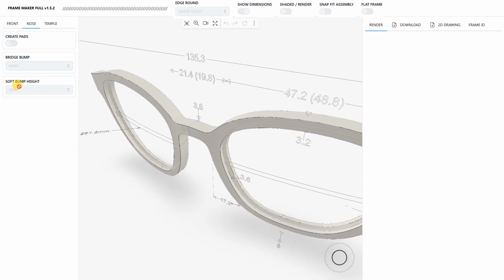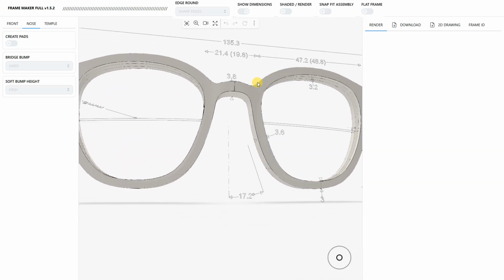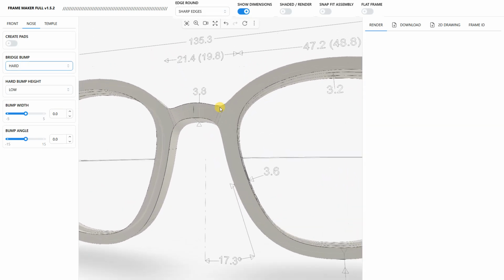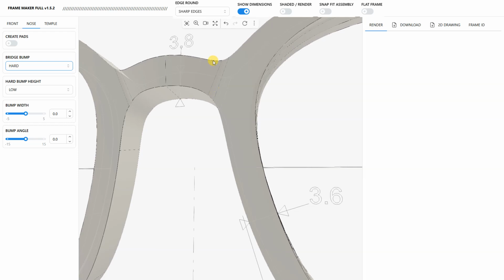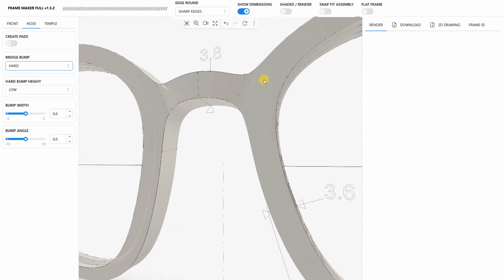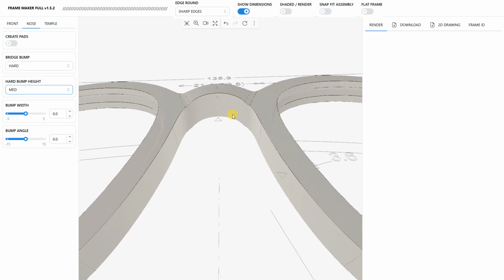If I wanted a hard bump, which is more akin to acetate, where we have an actual radius there. I call it a hard bump because it's more notorious. You can actually see that hard edge there. And again, we can do it low, medium, high, height. I'm going to leave it still there so you can see the update. And there it is. That would be medium.